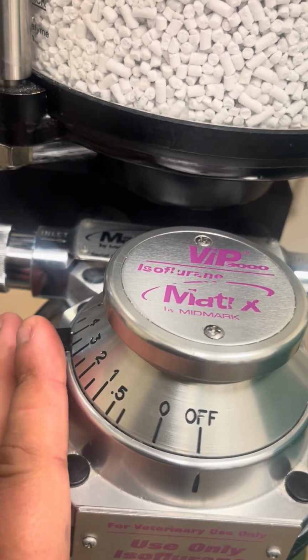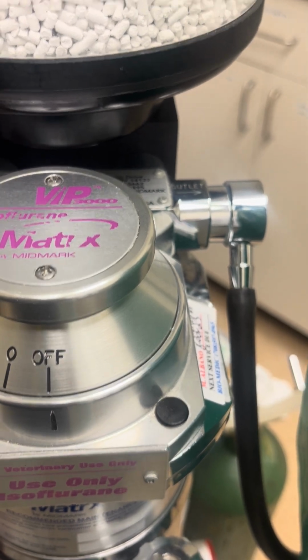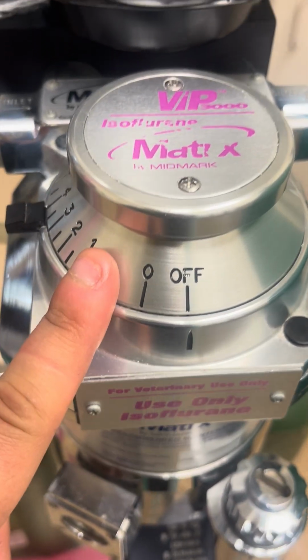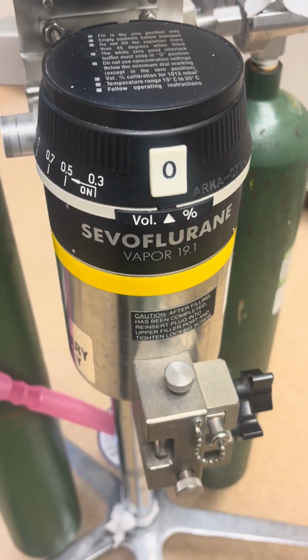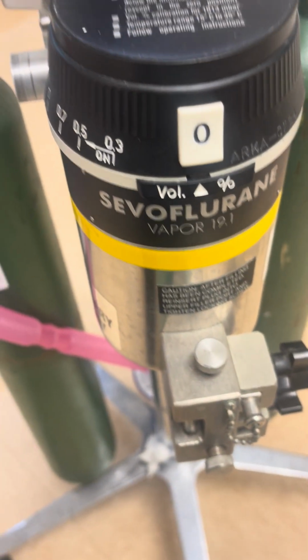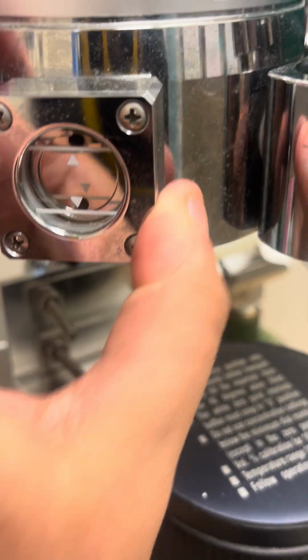I'm not going to play with it just because it's not on. And then there are precision and non-precision vaporizers. This is the one that we use in house, the isoflurane. The sevoflurane is another one that we can use, but we use the isoflurane mostly because it is a lot cheaper. It's about $10 per bottle, while this is about $200 to $300 per bottle. So this is a lot cheaper to use, and it is a little bit safer as well. And this is where you can actually see your liquid in here.